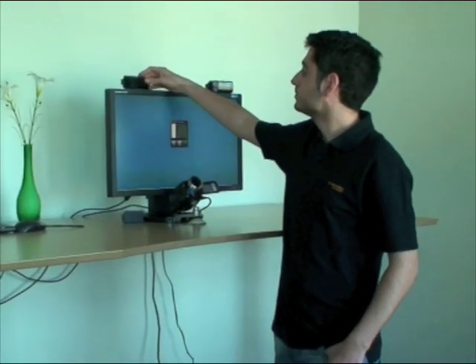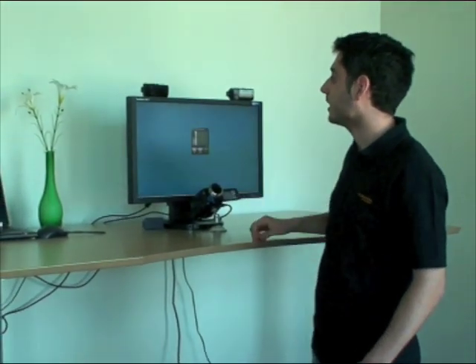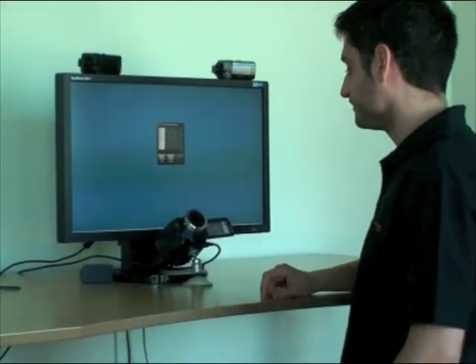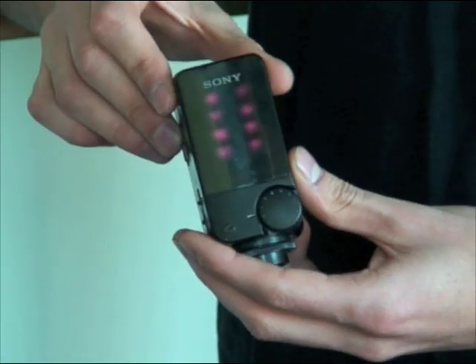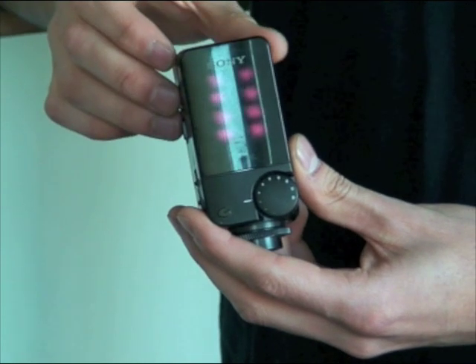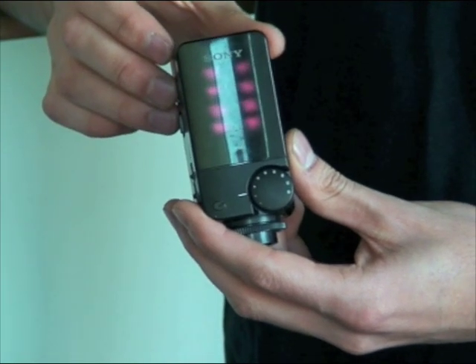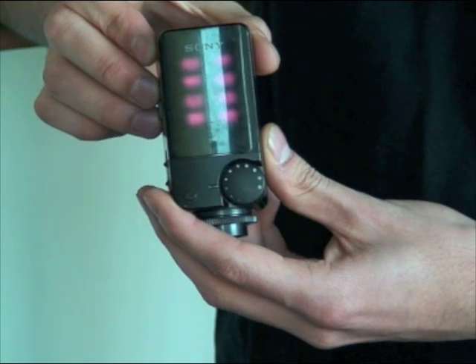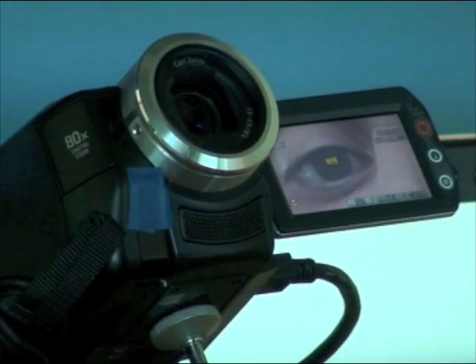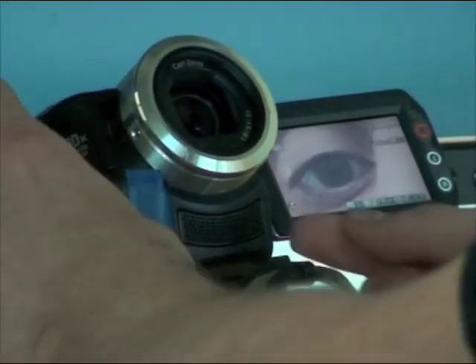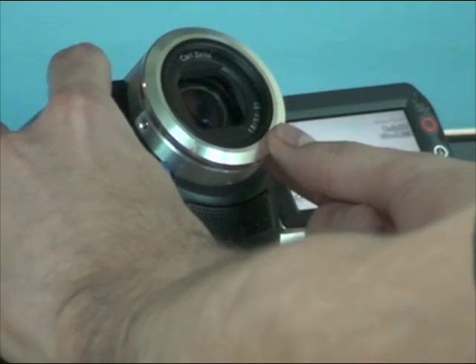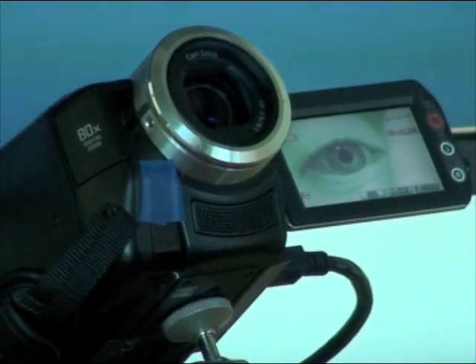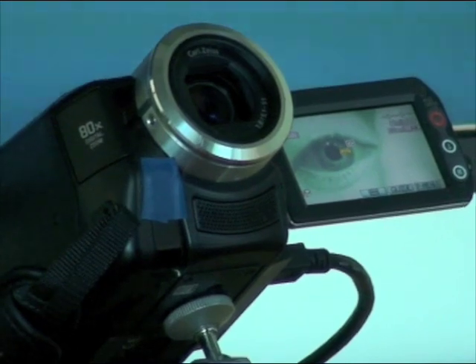We place both lamps on top of the screen and the video camera below the screen. This is a standard infrared lamp that you can buy in any computer or electronic shop. We activate the night shot mode of the camera and we cover the built-in LED with non-transparent tape.